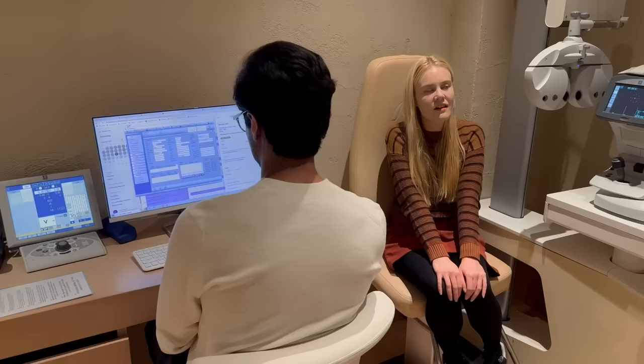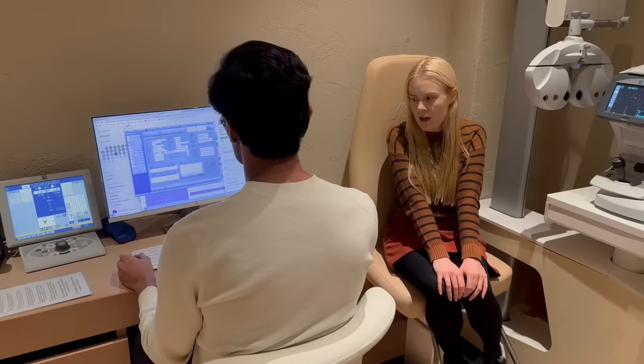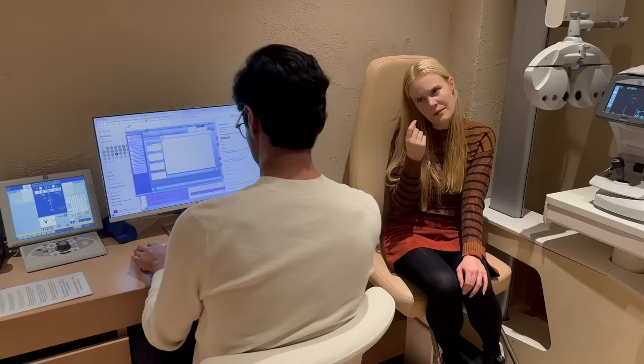Excellent. Thank you. Awesome. So I guess we should start by asking when your last eye test was. Yeah, I think probably about 6 months ago. 6 months ago, okay. Do you remember what they said in the eye test? No, so I had -1 in each eye. Okay. And then I think it's called astigmatism, in one of the eyes. I can't remember which one though.